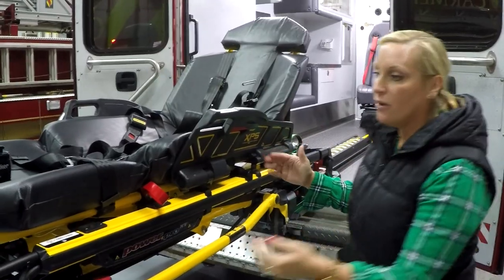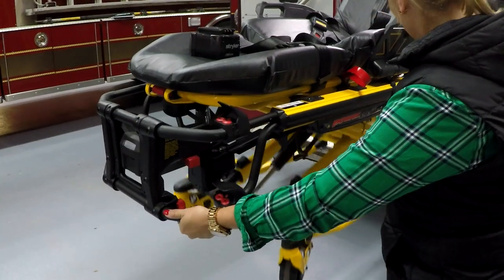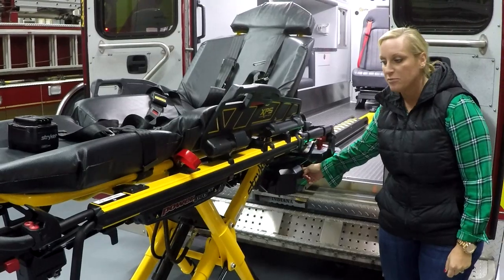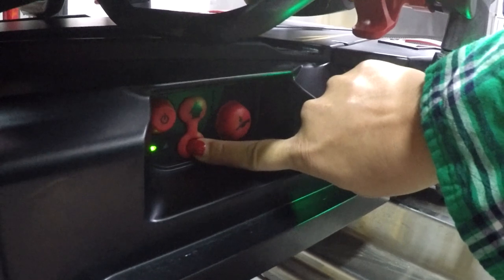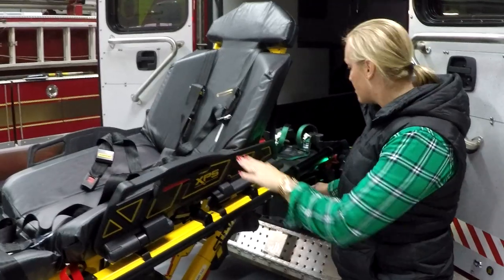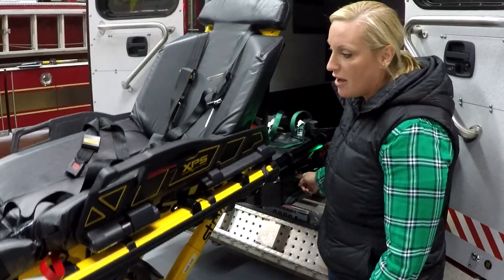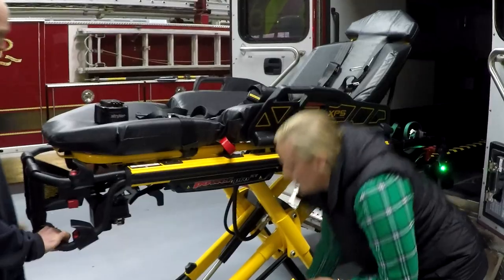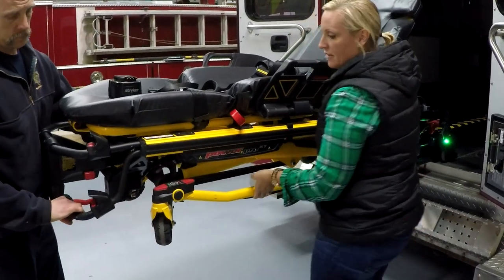When you have the cot pulled out in this position, you pull the manual release handle and the legs will drop. Then on the side, you're going to use the down button. To get the cot back in when there's still no power, use the up arrow — the arms of the power load will come up. At this point, pull the manual handle and bring the legs up manually. Then let go and you're good to load.